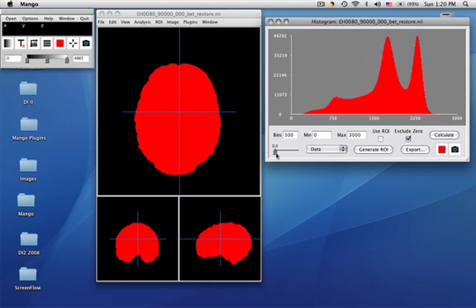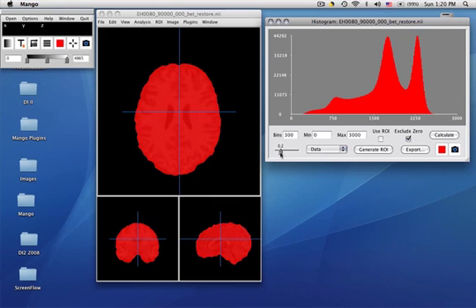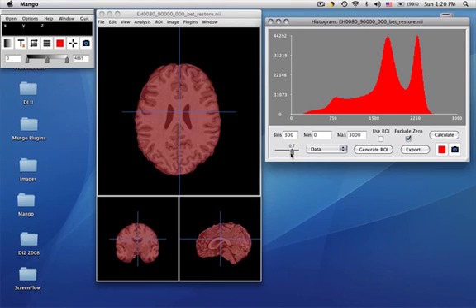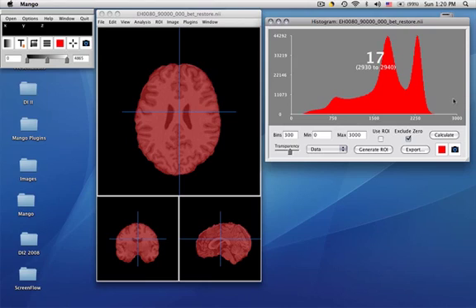I'm doing this to show that the overlay color that we placed over here, we can adjust the transparency of. And notice as I adjust it, we can begin to see the image beneath, and we can turn it off completely. So if you need to be able to see through the overlays, this is a good way to do it.